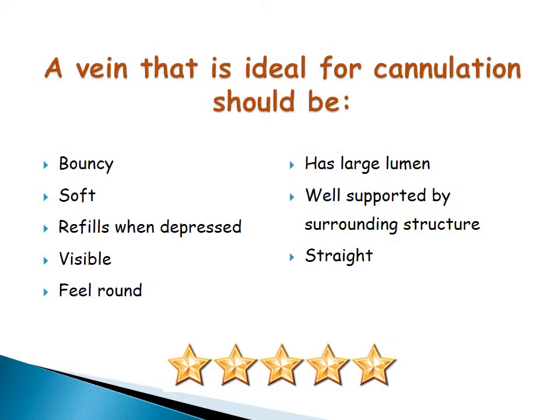A vein that is ideal for cannulation should be bouncy, soft, refills when depressed, visible, feel round, has a large lumen, well supported by surrounding structure, and should be straight.